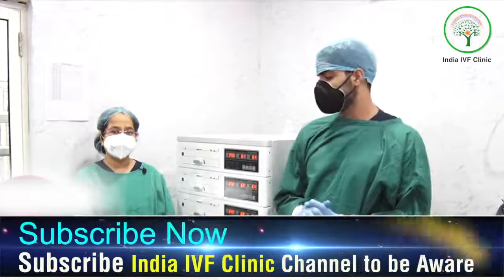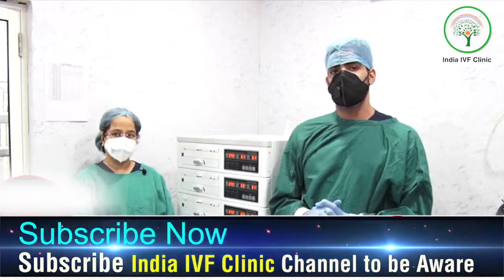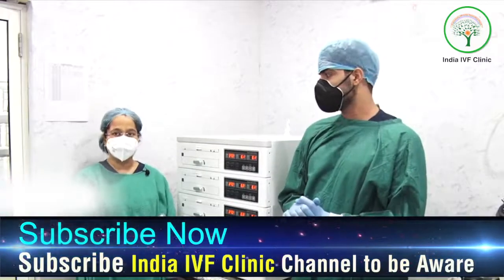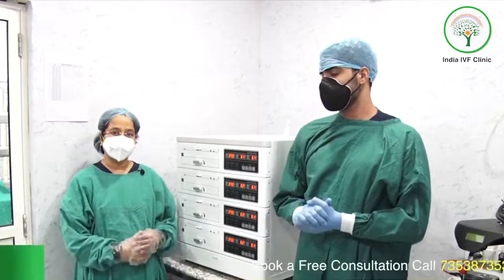This is our cube incubator — one of its kind in North India. It is basically a four-in-one incubator, so one incubator you are purchasing is equivalent to having four incubators. The embryologist will tell you the details about this.